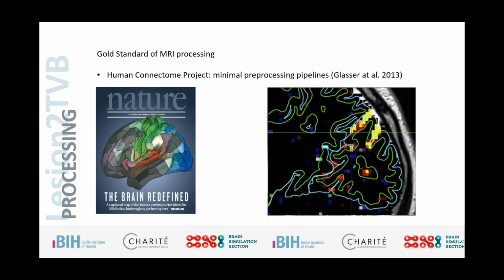Now, because we're talking about processing pipelines, we always want to take a look at the gold standard, and really the gold standard for processing these multimodal neuroimaging data, at least these three modalities that I've mentioned before: the anatomical, the functional MRI, and also the diffusion imaging. The gold standard currently is the minimal processing pipeline from the Human Connectome Project. It's Glasser et al. 2013, and in addition to this, a 2016 paper, where we can really see as the final result where we want to end up.